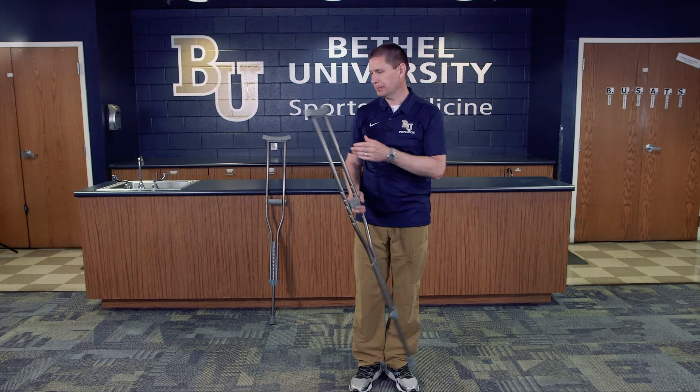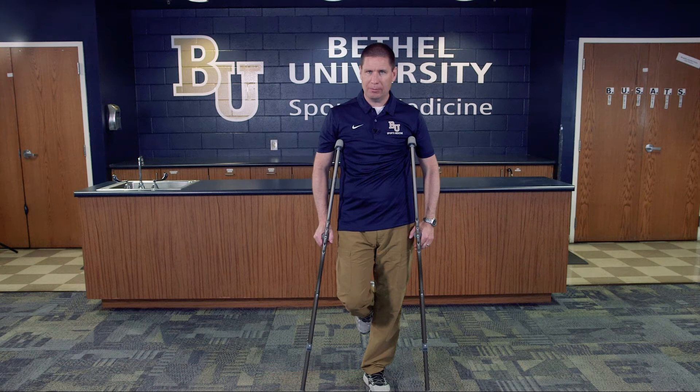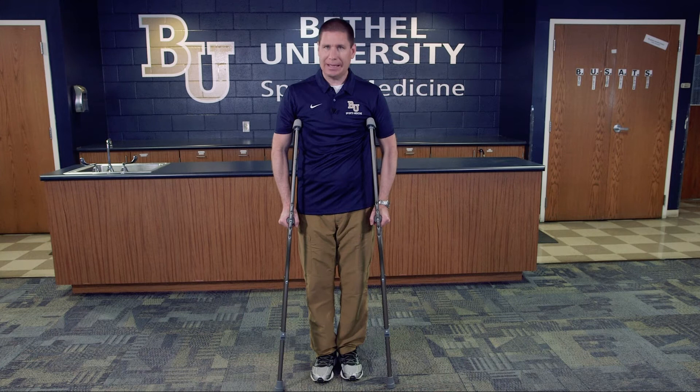Once you get an approximate measurement reading, you want the athlete to stand with both feet on the ground if possible — if they need to go on one leg because of the injury, that's no problem. From the very tip of their feet, you want to go up about two inches and out about six inches, and that's the starting point where you want to confirm your final measurements.